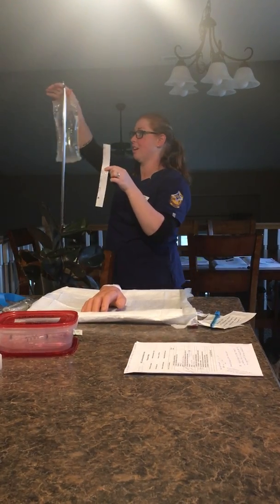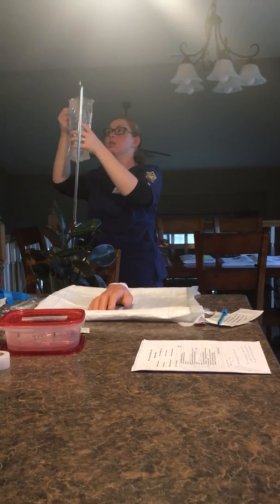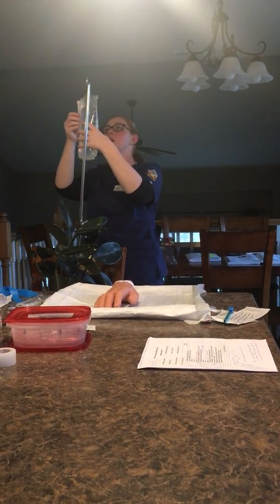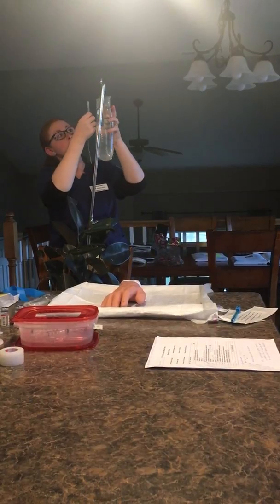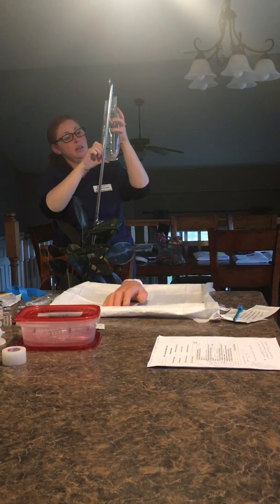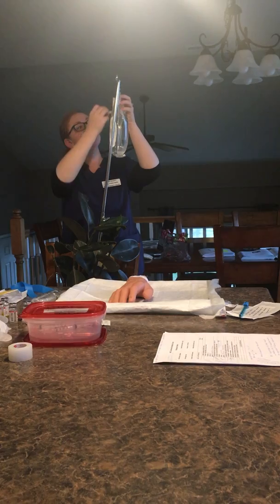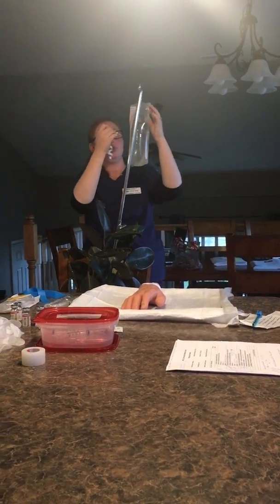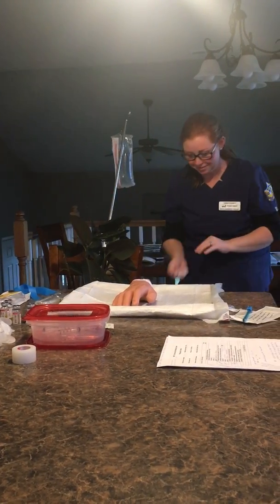We're gonna hope that stays there. Okay, so go ahead and apply my label. I'm gonna put it on the back side so that you can see the label on the front of this, just in case. We're just going to do that.